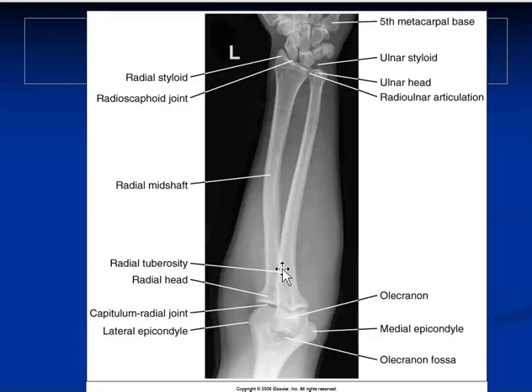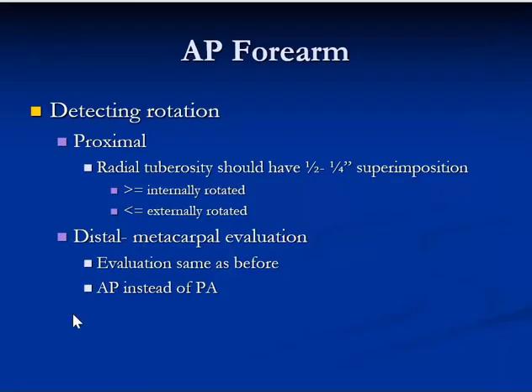You've got ligamentous attachment there that turns the radius around the ulna, so that you get a pivot right there, and this whole thing just twists around, right? So you should have that superimposition right there. On the distal end, you're going to have slight superimposition here as well. So if you have internal rotation versus external rotation, it's kind of going forward into elbows.